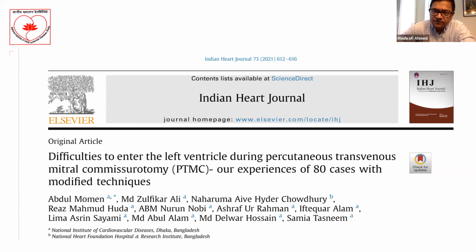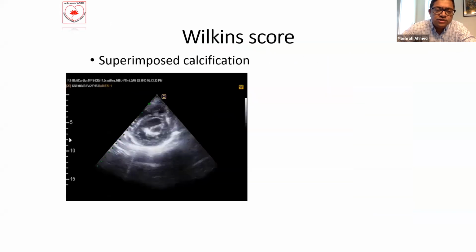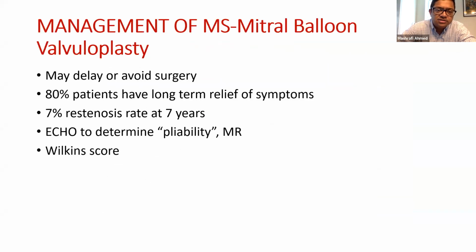Like first a different part and then I pull it back, keep it in the mitral position and then inflate fully. Sometimes it just slips off from the LV and it's very, very hard to go in. So this equipment needs to be improved some way or other because it's challenging.